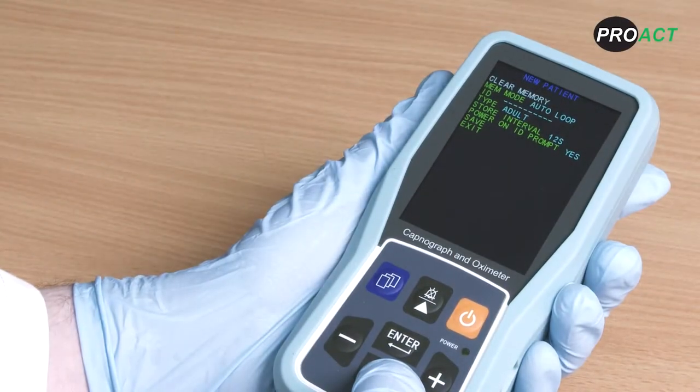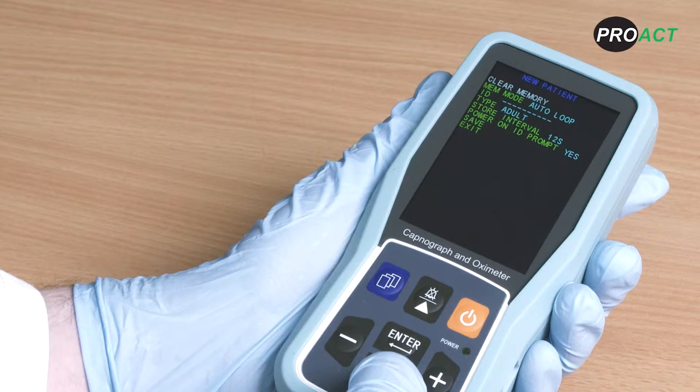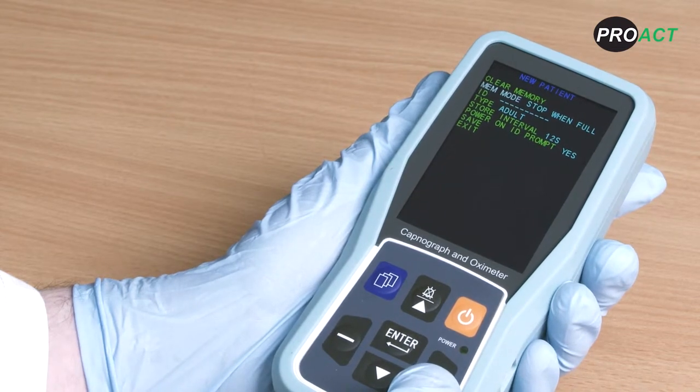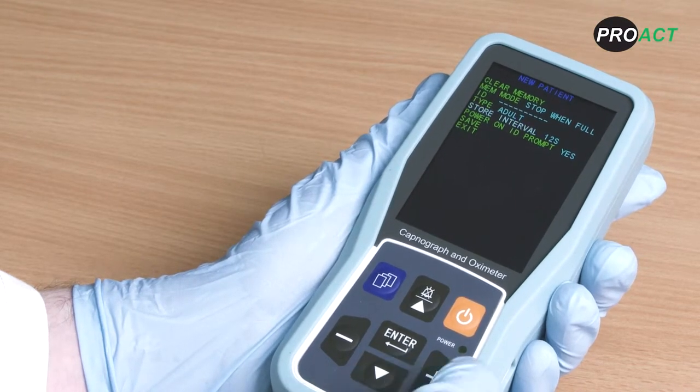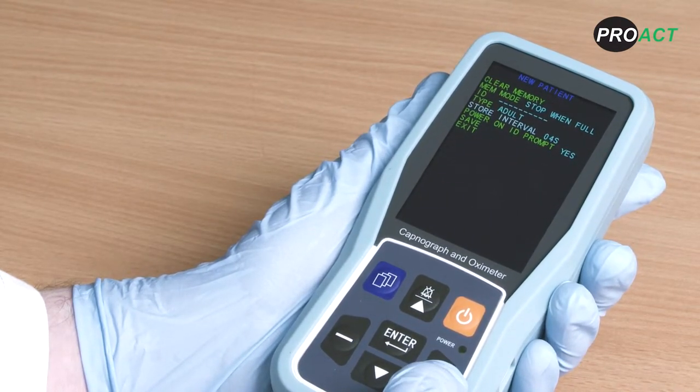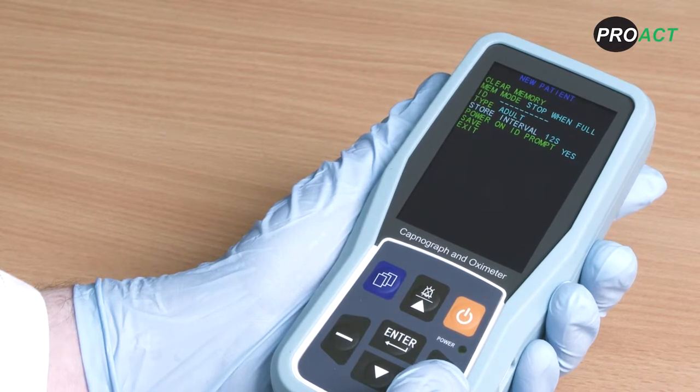You can modify the memory mode, choosing to set it to either auto loop or stop when full. Auto loop takes 24 hours of trending memory, but as soon as it has reached 24 hours it will delete the oldest data to record new data. Stop when full will inform you when you have reached the maximum memory. You can also change the store sample rate to 12 seconds for 24 hours memory, 6 seconds for 12 hours, or 4 seconds for 8 hours. The longer the sample rate interval, the longer the memory. The PC900B default is set to 12 seconds store sample rate.